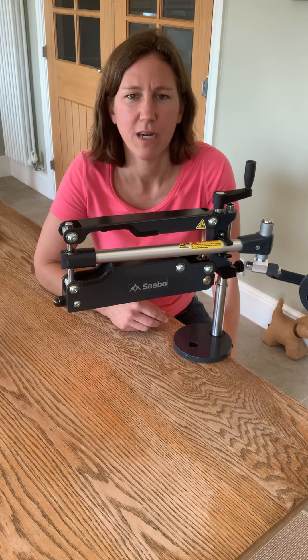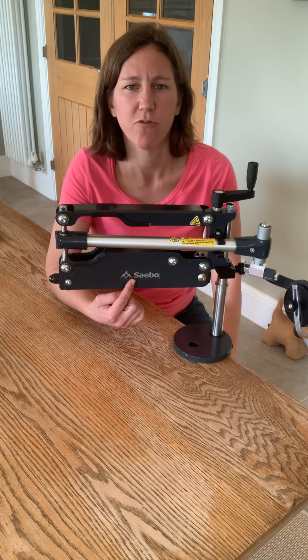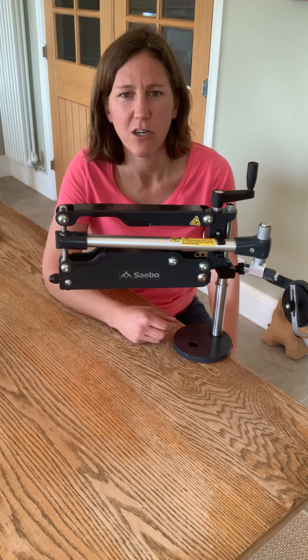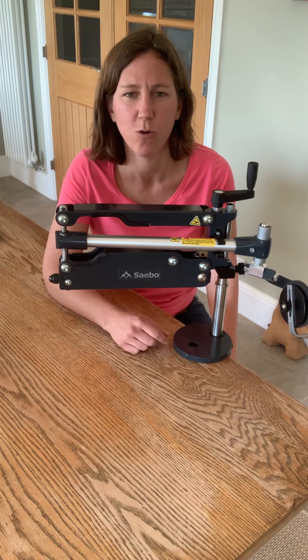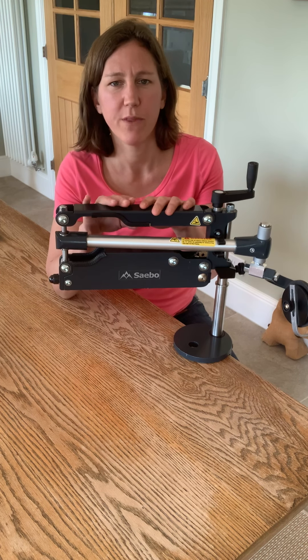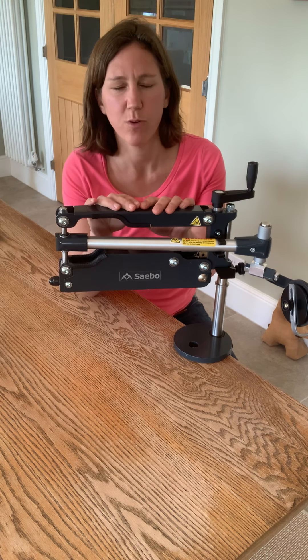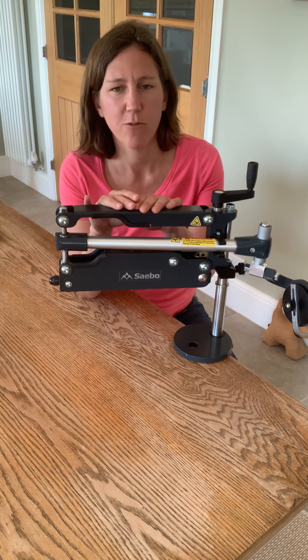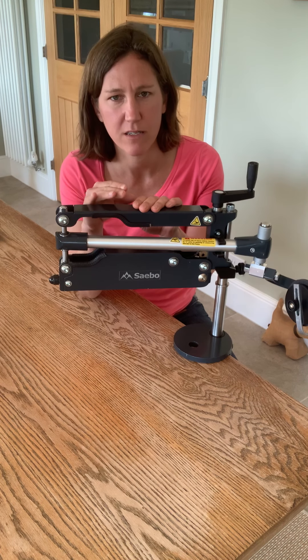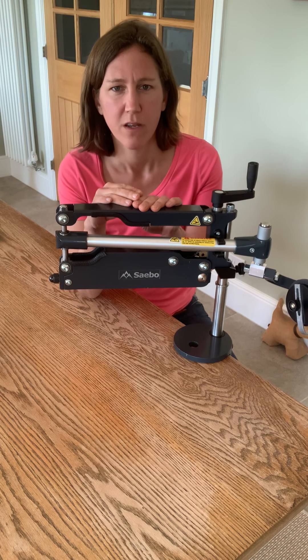Hello, my name is Amy, I'm a clinical specialist with Saebo UK. In this video I'm going to go through using the SaeboMAS Mini to help you practice some everyday tasks, looking at grasp and release with your affected hand. This is a de-weighting device for those of you who've got weakness in shoulder and elbow. You may have a hand that always tightens up with any effortful tasks, so by taking away the effect of gravity the movement is easier, less effort, and the hand becomes lighter and looser to practice those tasks.